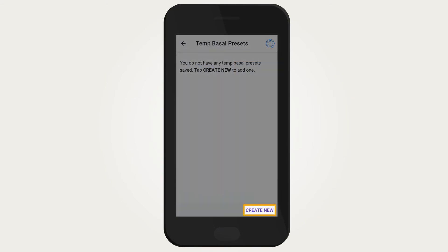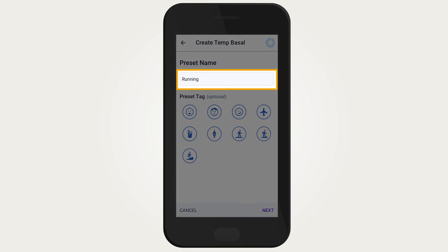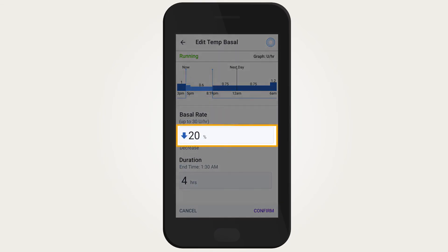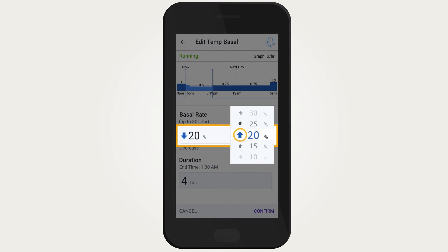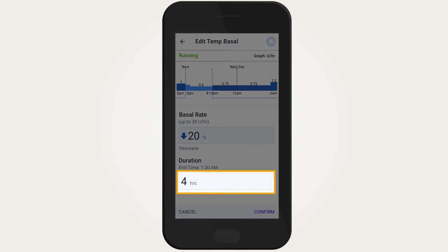Tap Create New to create a new temp basal preset. Tap on the Preset Name field to name the temp basal preset. Tap Next. Tap on the Basal Rate Entry field to enter the desired change in basal rate. Scroll up to choose an increase and down to choose a decrease in basal insulin delivery. Tap on the Duration to choose the length of time you would like this temp basal to be active.